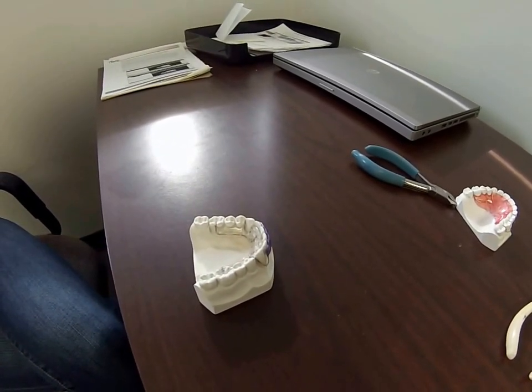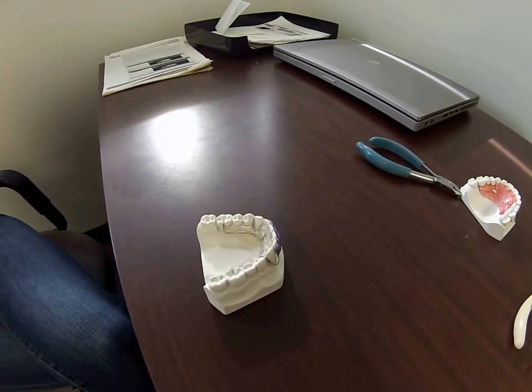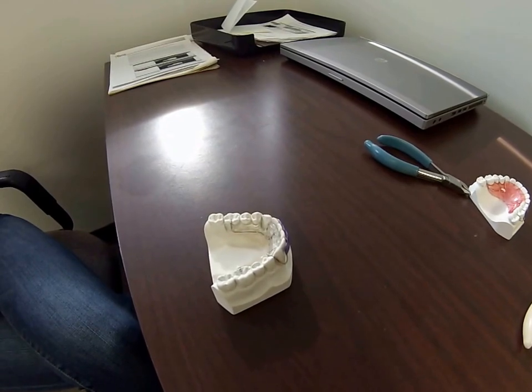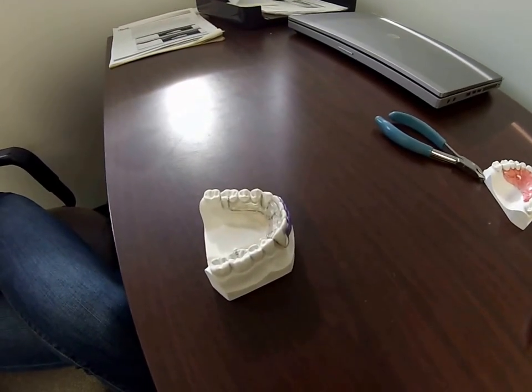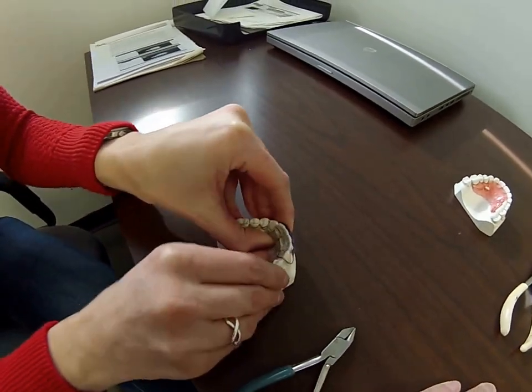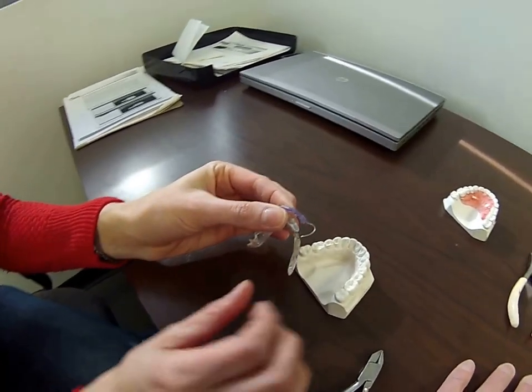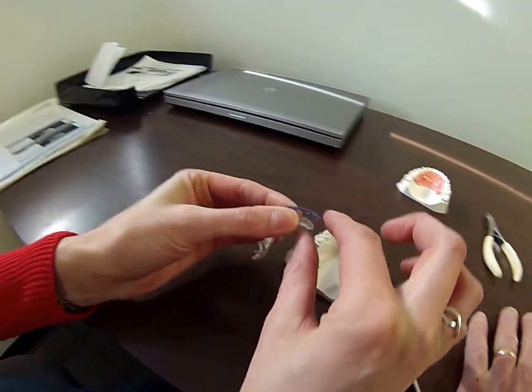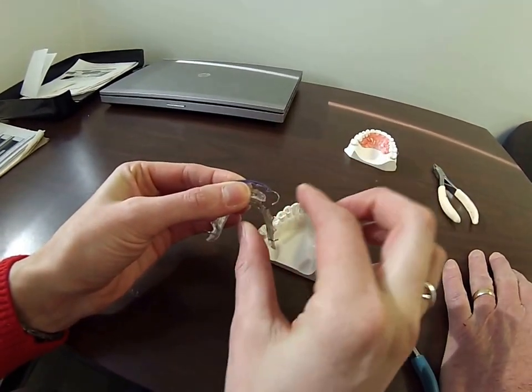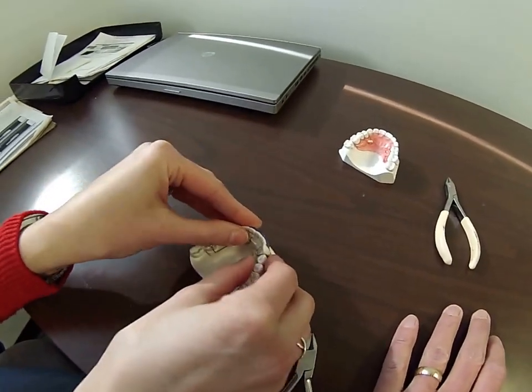The first adjustment is to bring the canine loops back down tightly up against the facial surface of the canine. Megan's going to demonstrate the right canine loop. You can see where it is away from the tooth. The technique we're going to show you is with your fingers — simply support it in your left hand and with your right hand, your thumb and index finger, squeeze the loops together.